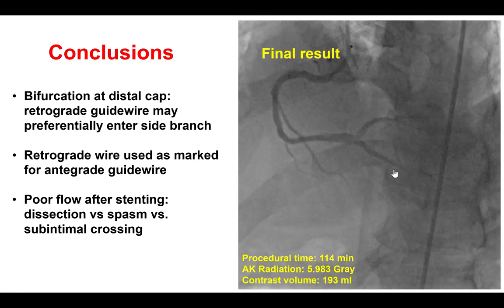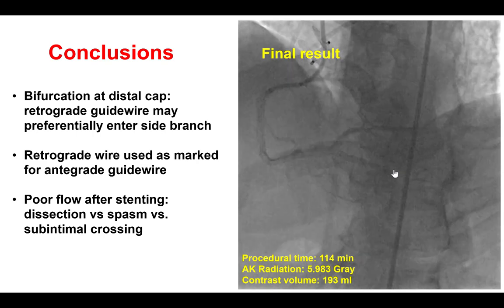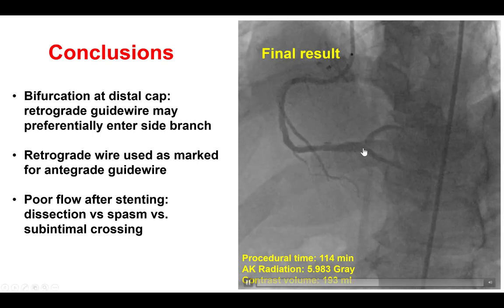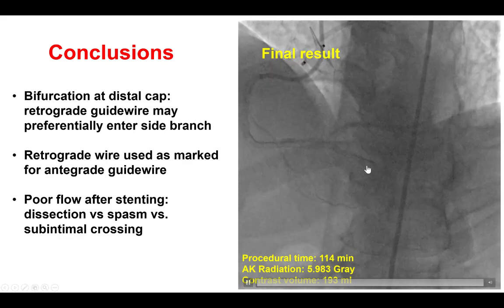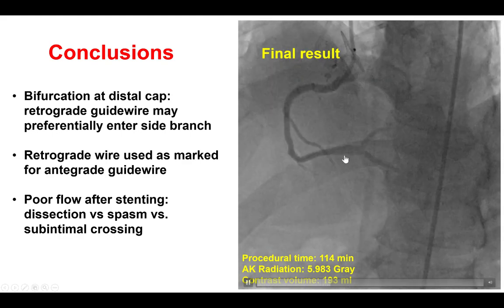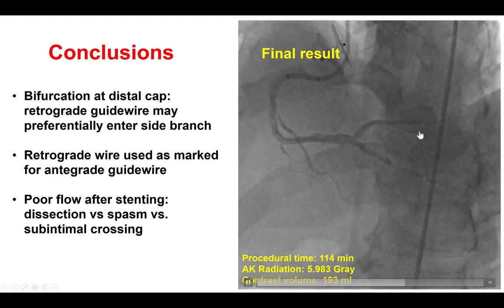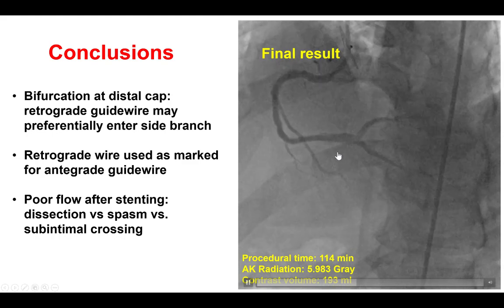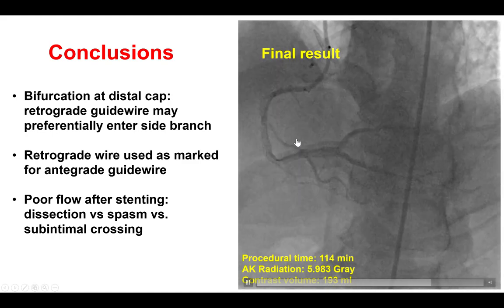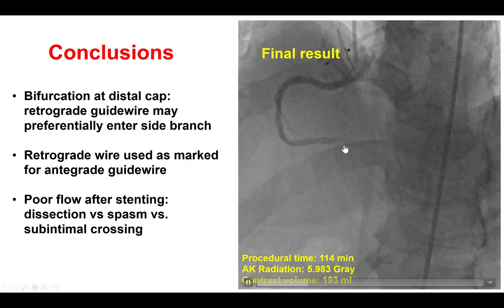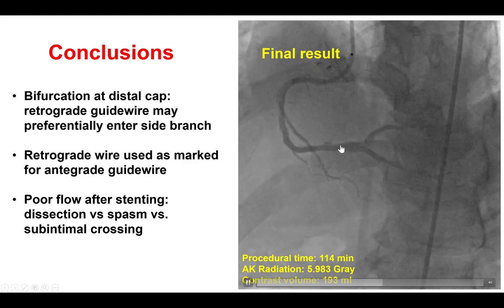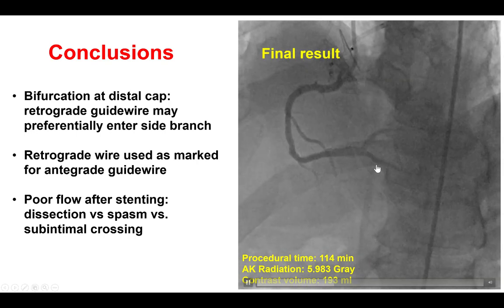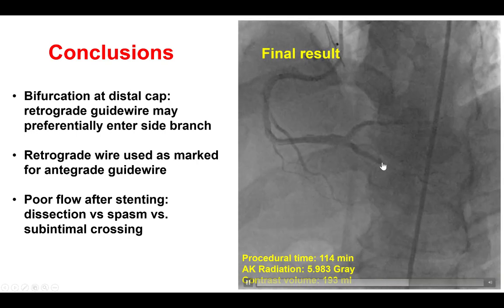Several lessons from this case. The first one is that having a bifurcation at the distal cap of a CTO can be challenging to cross with either antegrade or retrograde crossing. In both cases, the antegrade wire went to the posterior lateral and the retrograde wire went into the posterior lateral. Eventually, what made the difference was advancing a dual lumen microcatheter over the antegrade wire and then advancing a Pilot 200 towards the retrograde guide wire that acted as a marker of the posterior descending artery.